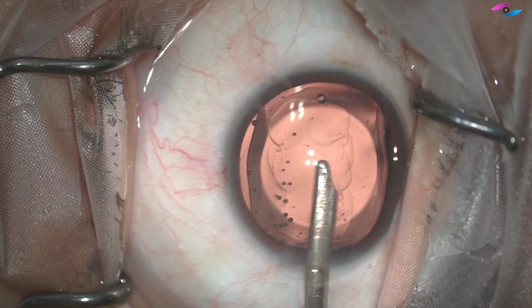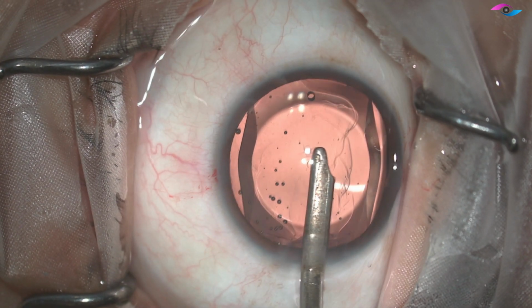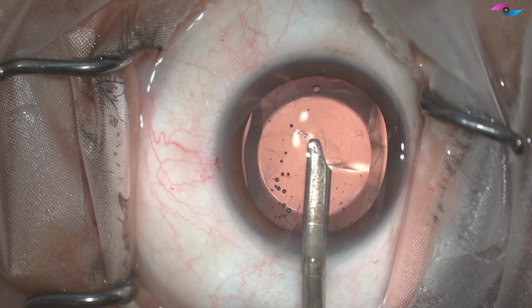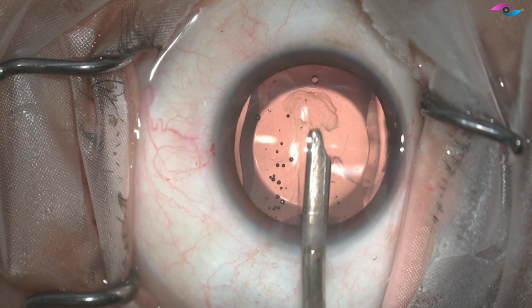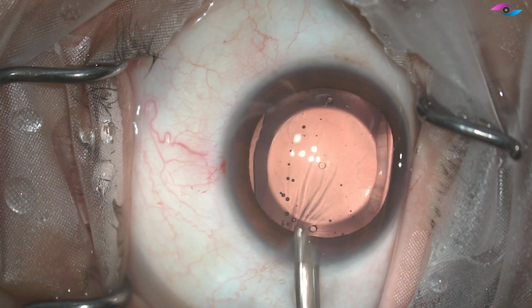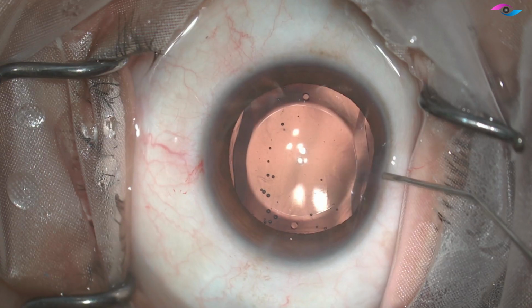Now we are removing all this viscoelastic using a Simcoe's cannula here. I prefer to use Simcoe's cannula because it puts lesser pressure on the eye, although an irrigation aspiration can also be used, that we typically use for phacoemulsification.